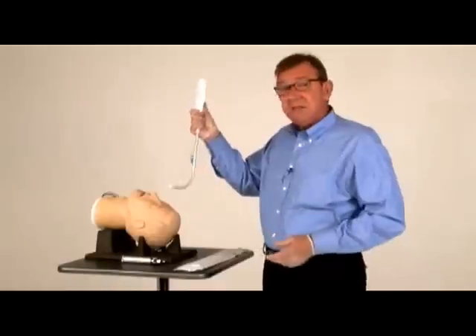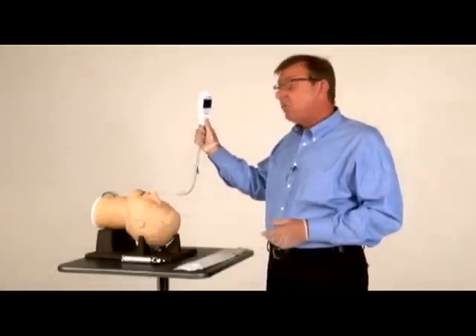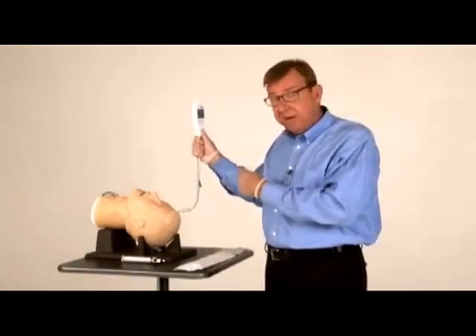To use it, you hold it at the top, keeping your thumb on the bottom of the video handpiece. This will allow you to bend the screen forward as needed so that you're able to maintain a direct line-of-sight view with the screen while you're intubating.